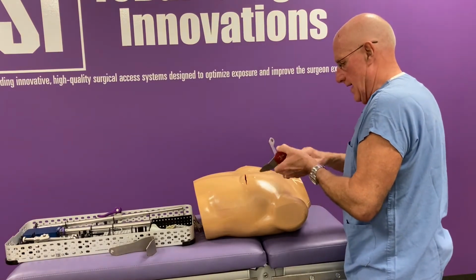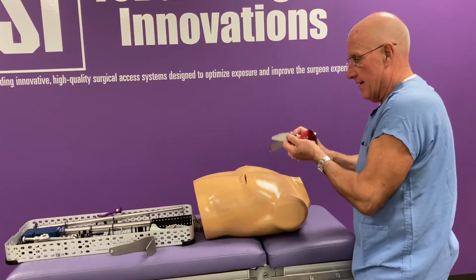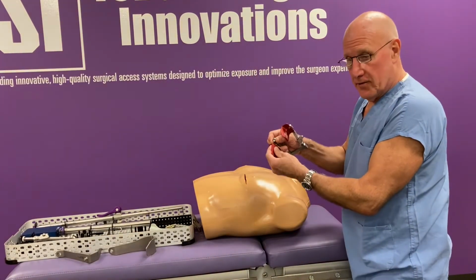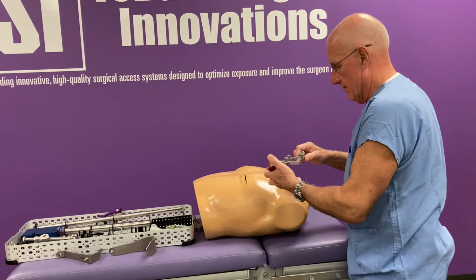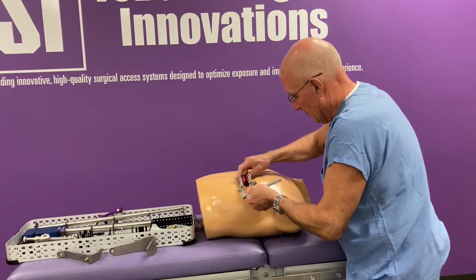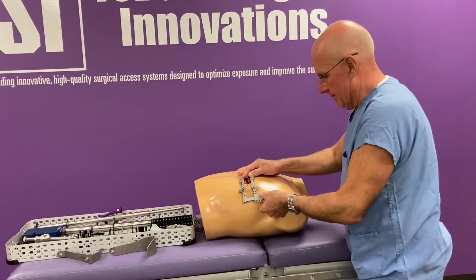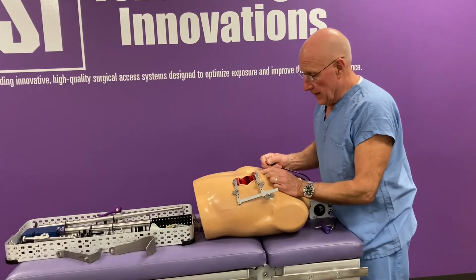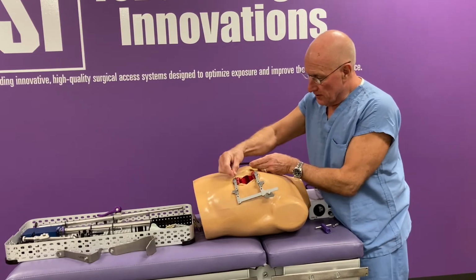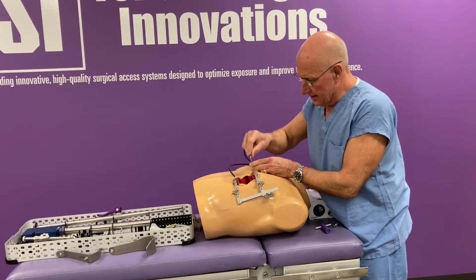We're going to remove that lift blade and replace it with the upper retractor blade. Okay. I'm going to put it back in the incision. Okay, now that we've inserted the retractor and spread, we can go ahead and put the lighting into the system.